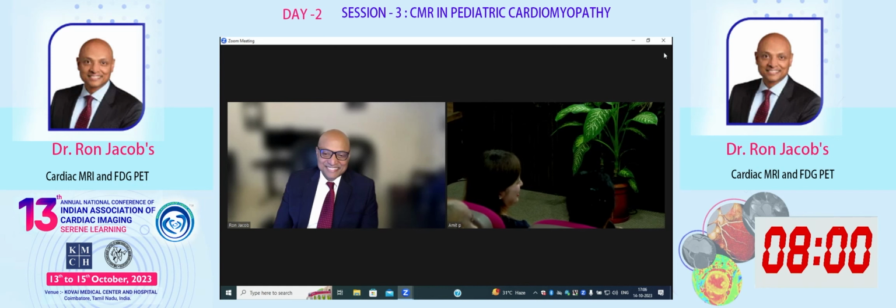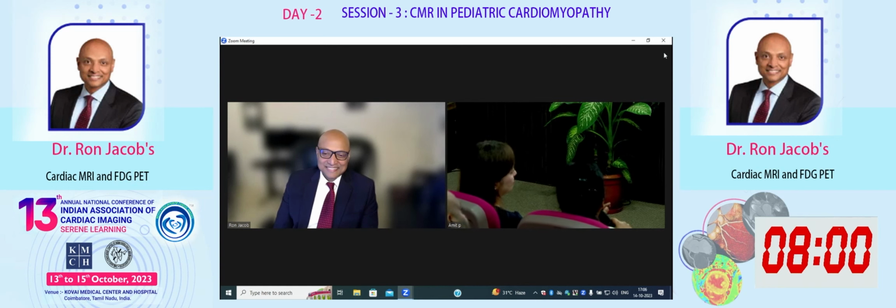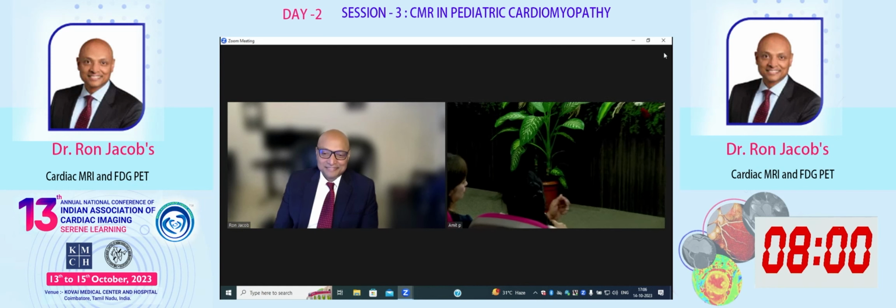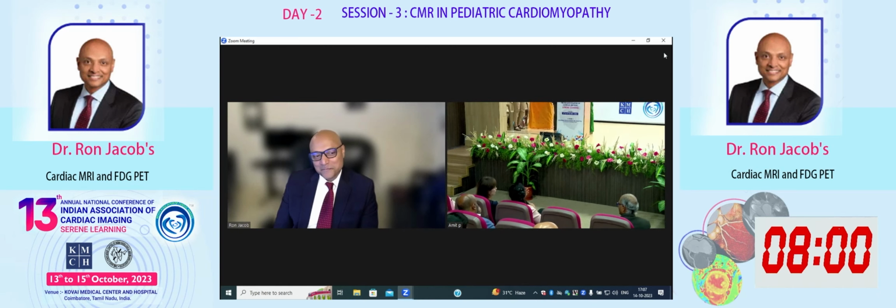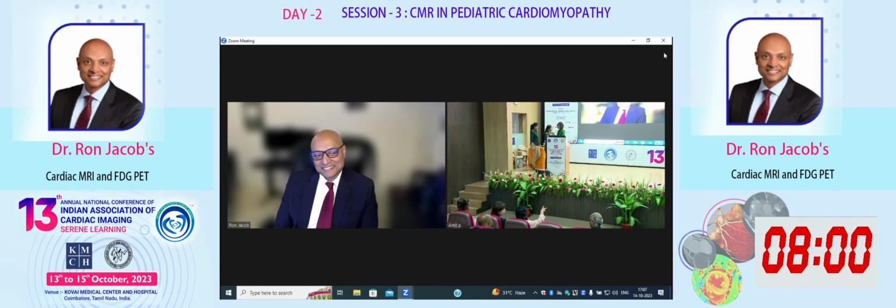You talked about ECV being different in males and females. So what about female mapping values? We have 100 volunteers. If I take a 20-year-old female versus a 70-year-old female, same for male and female, do you think we should have a variety of sex, age and BMI related values?